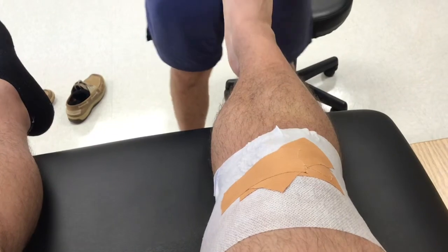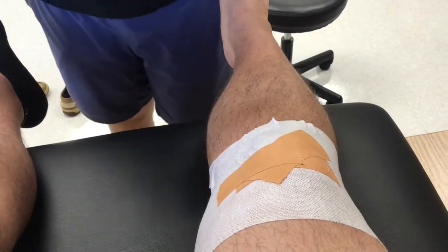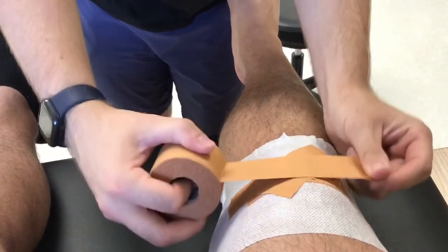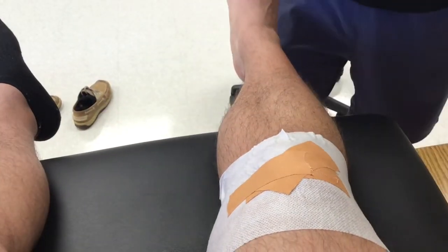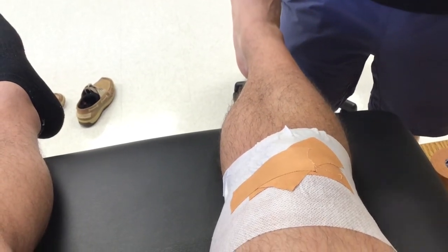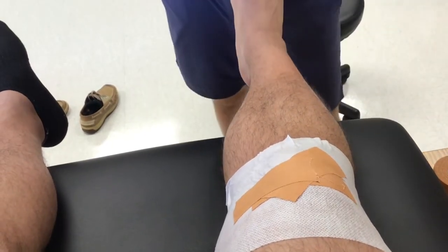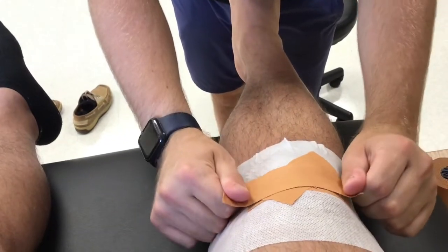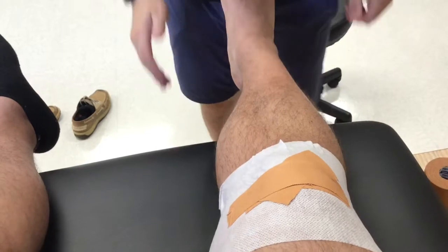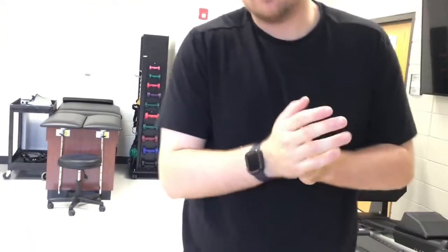Then this last one is the anterior posterior correction. It's gonna be one nice strip right across the entire knee going on both sides, covering up everything we just did. Nice pull right over the top, and then at this point I would cover him up with some kind of compression sleeve to send him back out, and he should be good to go.